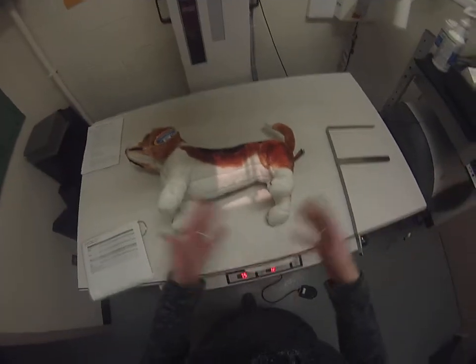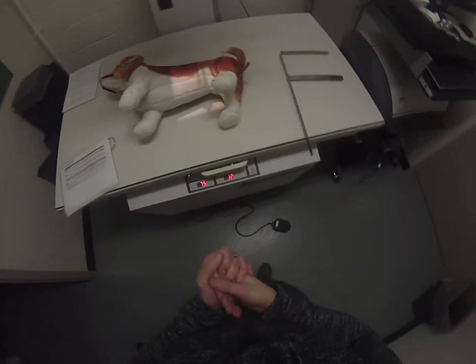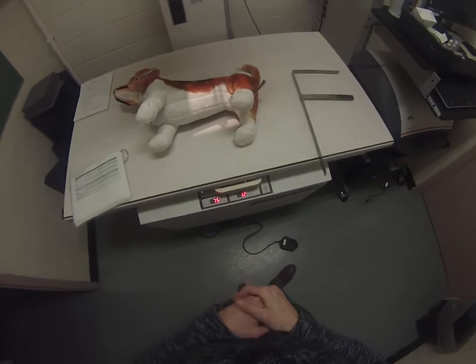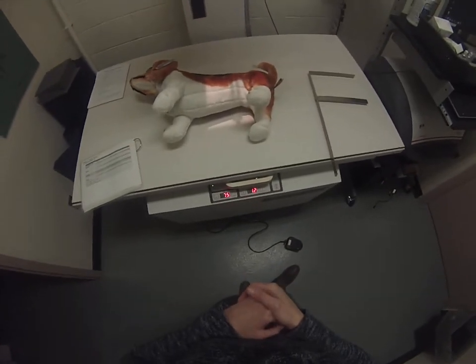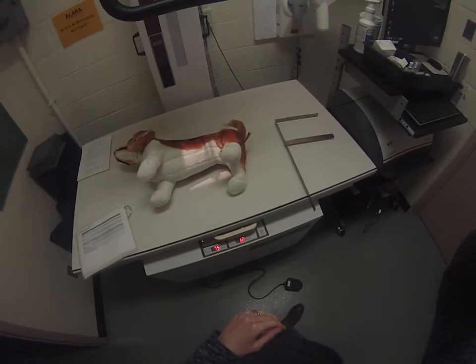We would now expose our radiograph using the foot pedal and watching that prep button, and then we will go from there.